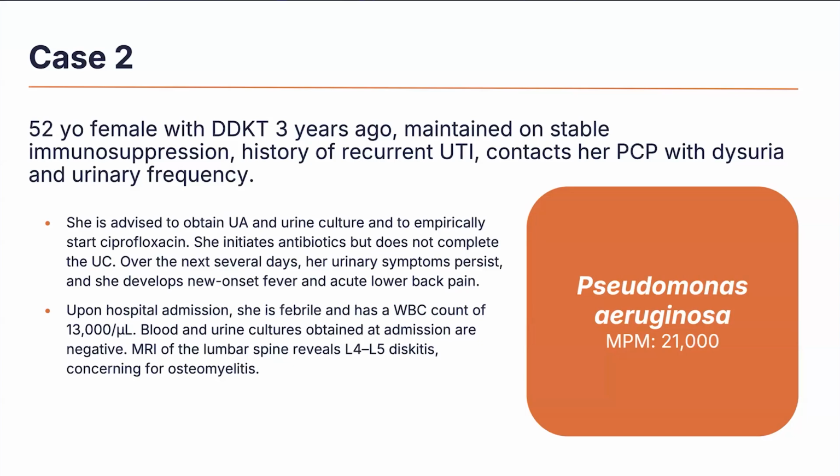On day 7, we have the susceptibility report, which shows that it's resistant to cefepime and fluoroquinolones, the antibiotics the patient has received in the past, but sensitive to carbapenems and other antimicrobial agents. So here you see the benefit of both tests in their own rights.